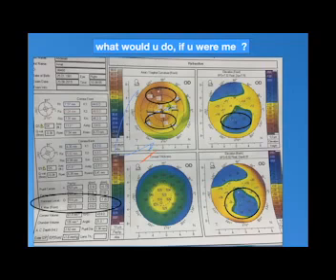The superior circle is bordering the highest points, 51, 49, 49.5. The inferior, which is opposite to the superior, is 48 and 44.9. So far there is a high difference between both. Up till now, it's irregular, but I have a question from Dr.